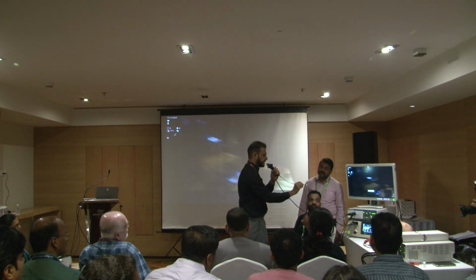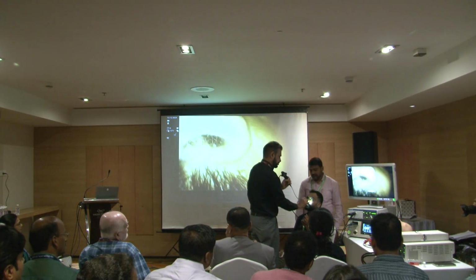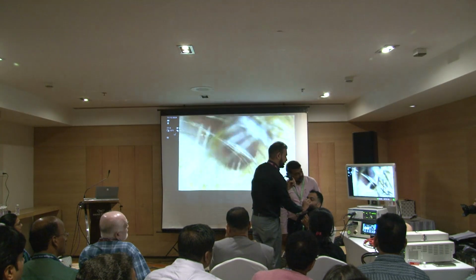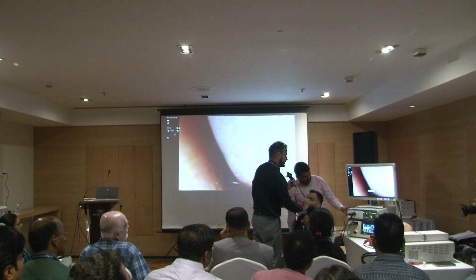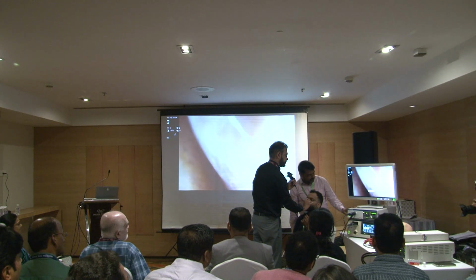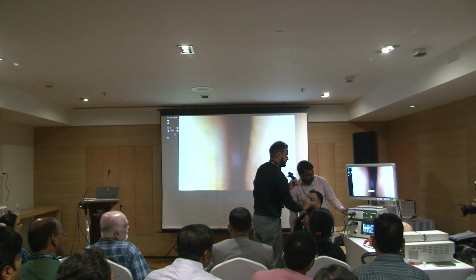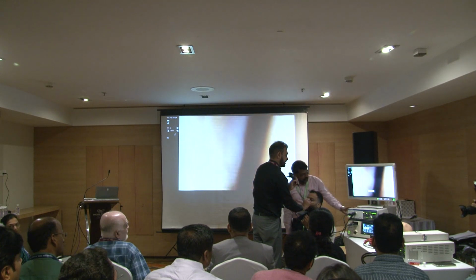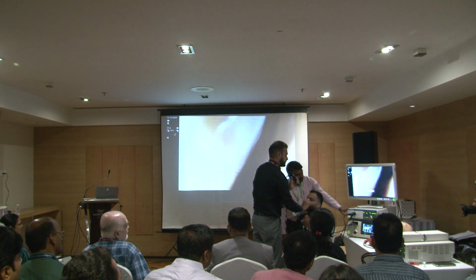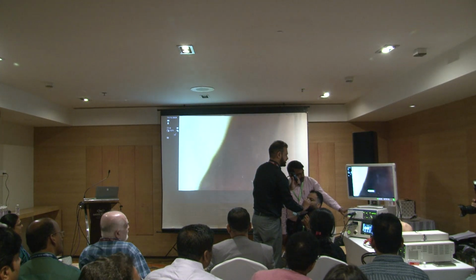Once you reach the nose, we tell the patient to breathe from the mouth. Keep the mouth open and breathe from the mouth. And now I am very, very close to this area. As I go inside, keep breathing from the mouth. Now I have reached the nasopharynx.